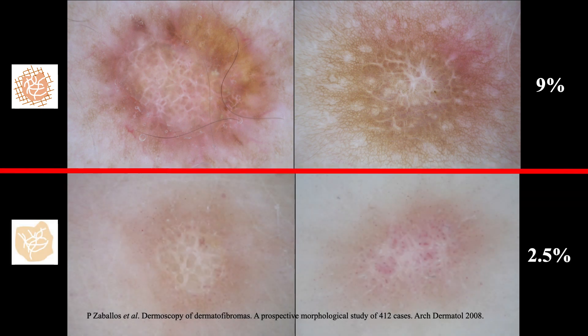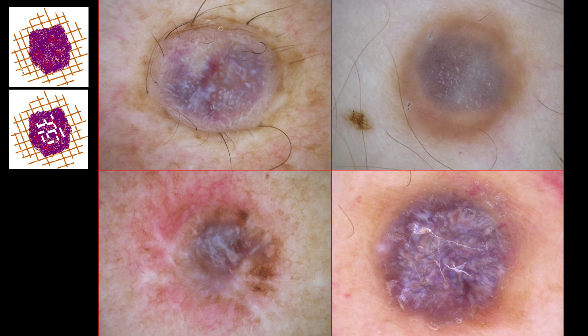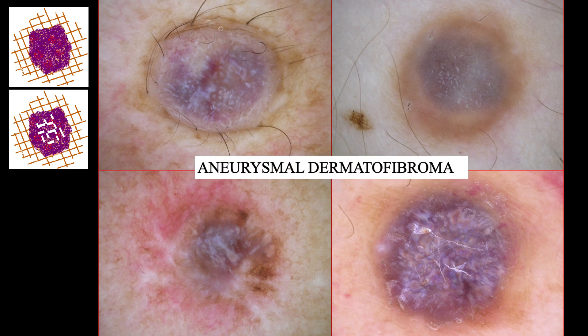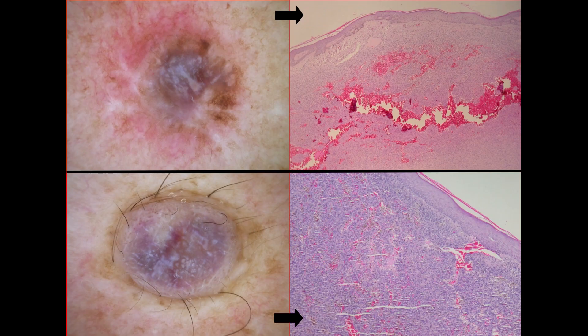We can also see a white network located throughout the lesion. In other cases of dermatofibromas, instead of the central white scar-like patch, we can observe a central red-bluish or red-violaceous homogenous pigmentation or structureless area, sometimes with chrysalis or white streaks, as we can see here. In our study, all dermatofibromas with this pattern were aneurysmal dermatofibromas. The histopathologic correlation of this structure could be the presence of prominent blood-filled spaces and intra- and extracellular hemosiderin deposits.